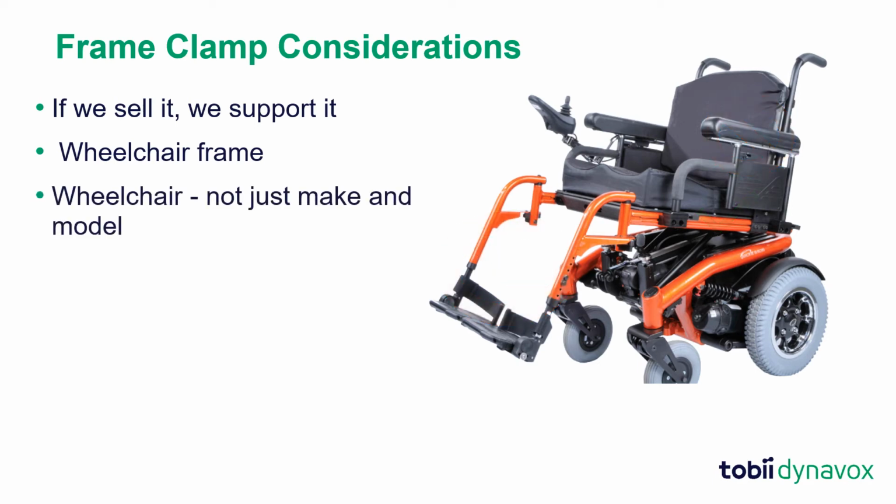In deciding on a frame clamp, you need to see the wheelchair itself. Don't make assumptions because you know the make and model. It is better to order the frame clamp when you are 100% certain and have visually inspected the wheelchair. The make and model of the wheelchair is important.